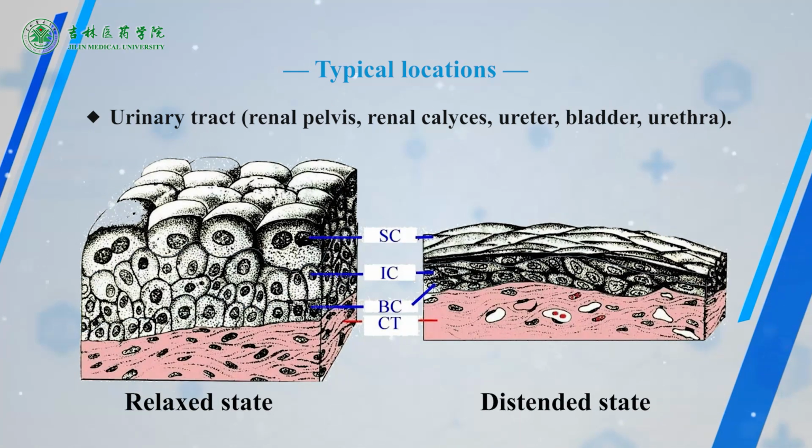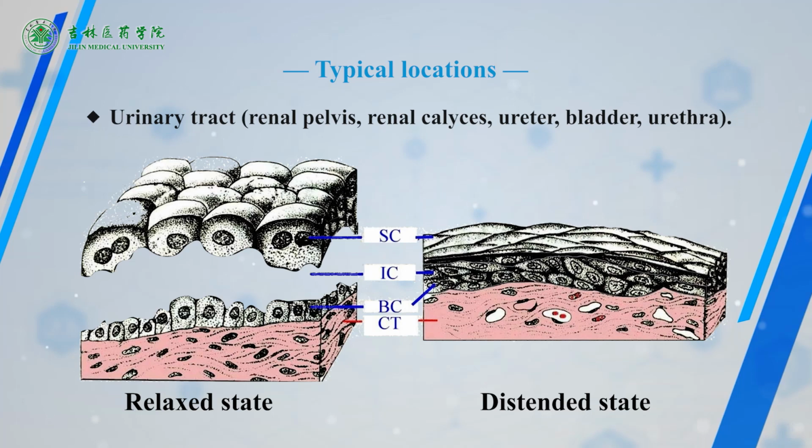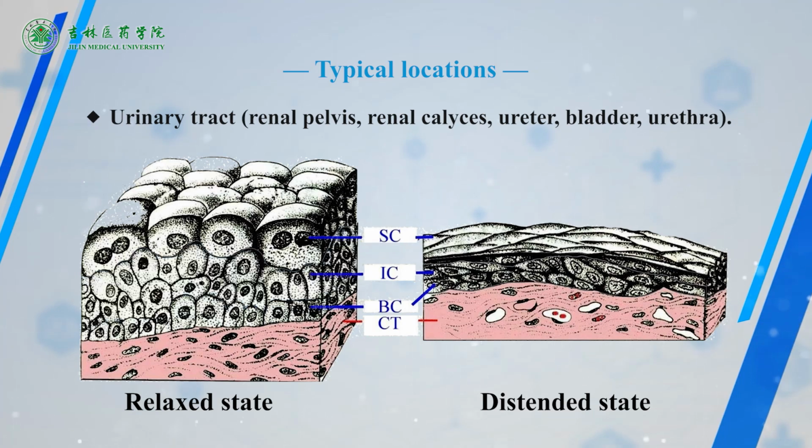Look at the diagram. The left is the urinary bladder in relaxed state. The epithelium becomes 5 or 6 layered. The surface cells are large and cuboidal, with a superficial layer of cytoplasm, which often appears condensed and darker in HE preparations. This multi-layered epithelium is characterized by a surface layer of dome-shaped cells. Occasionally, 2 nuclei per cell can be observed. Adjacent layers contain cells that may be cuboidal, columnar, or polygonal in shape.